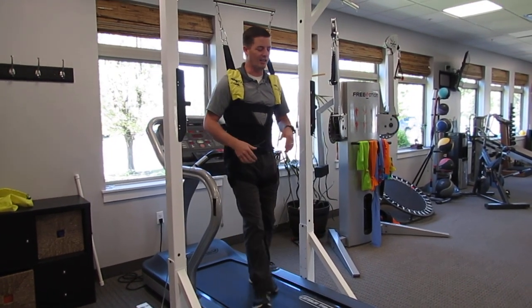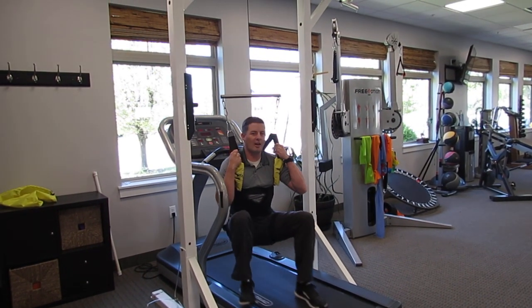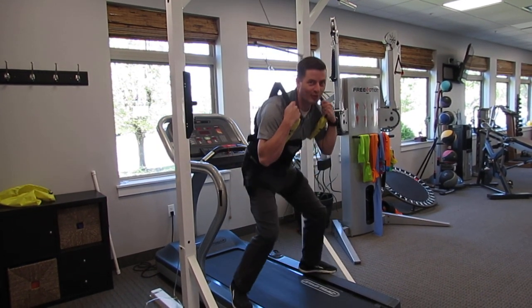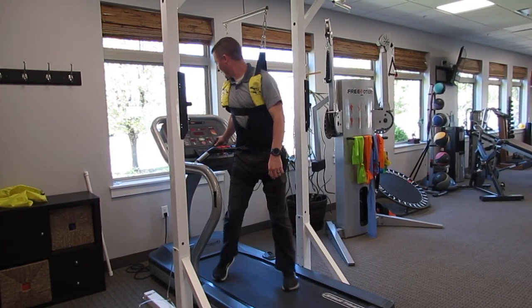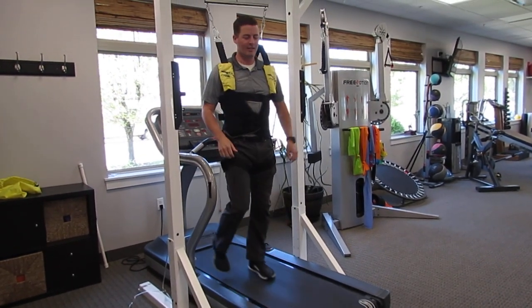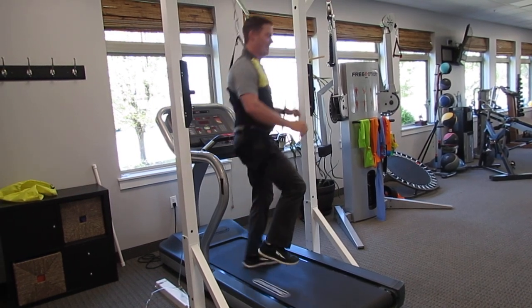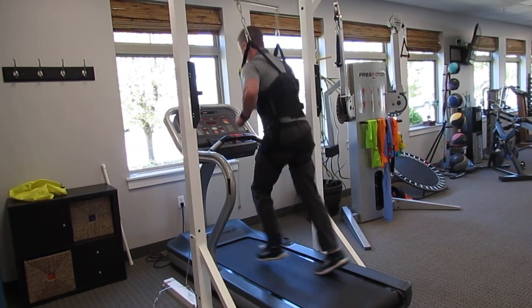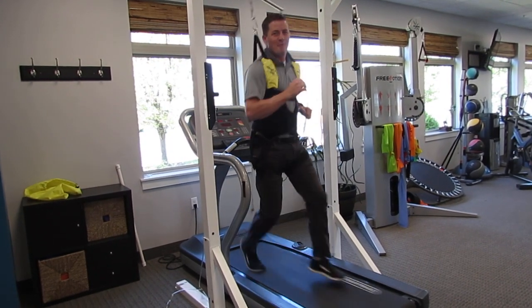It also helps with safety while you're walking on the treadmill — you can fall and not have any issues other than trying to get back up. It allows us to do a lot of things we can't do otherwise: you can run backwards, sideways, forwards, or more sideways.